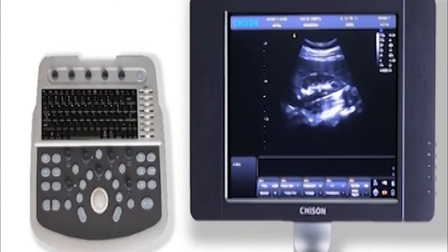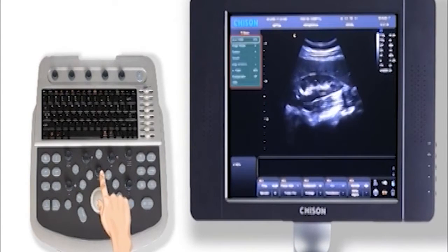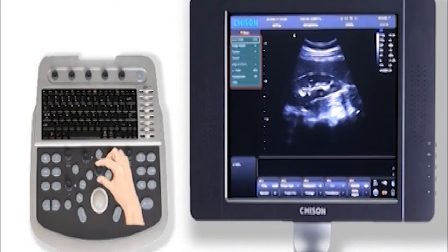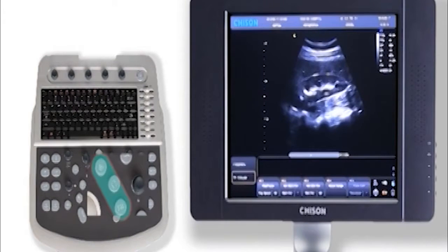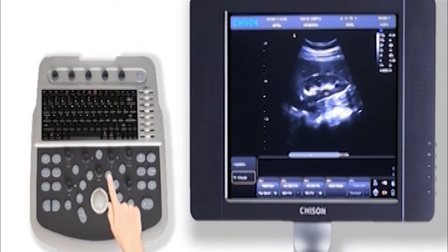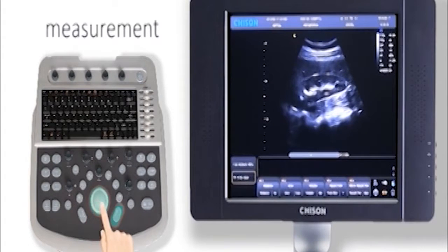Also, we have some other parameters. Press the menu button and they will show out. This area is for measurement. Press this button to do distance measurement with trackball and enter key.